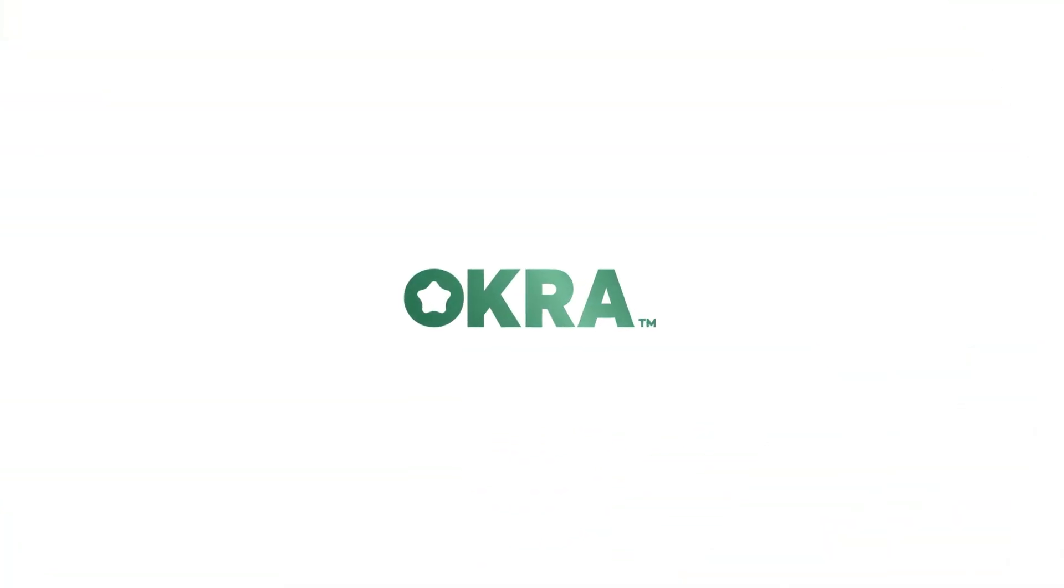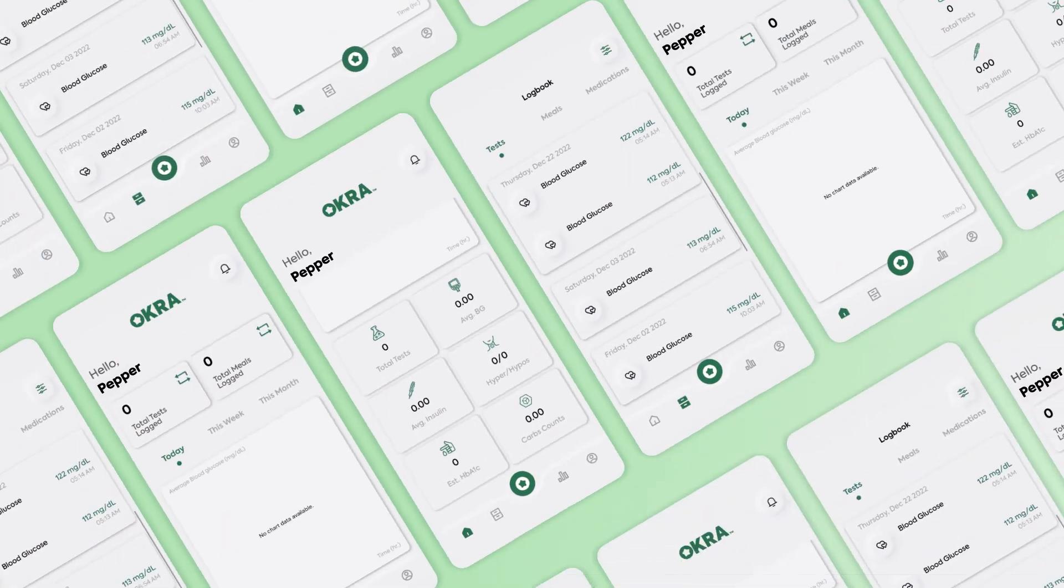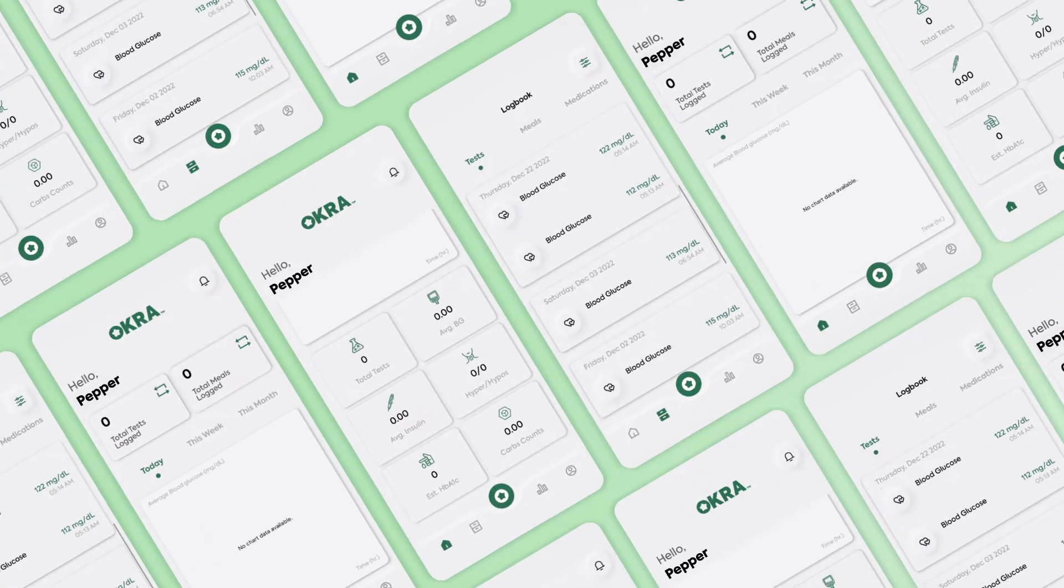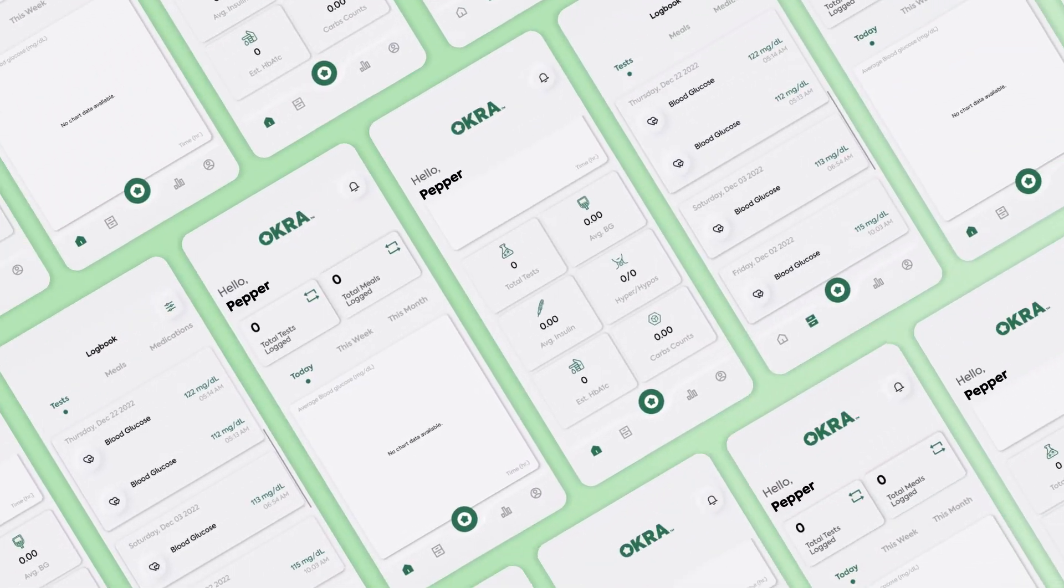Okra Care helps you keep it simple and convenient with the new Okra Pro app. The app is made to log your test results, meals and medication to better manage your diabetes more effectively daily.